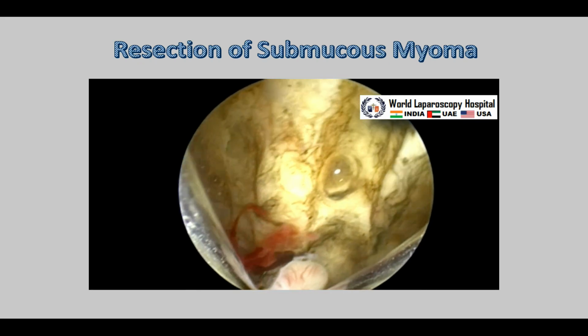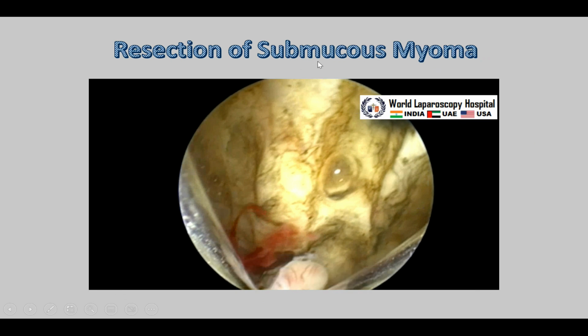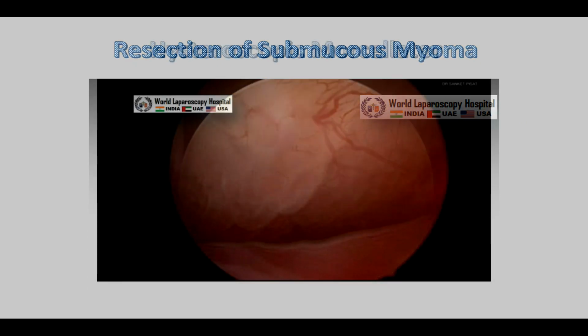If you see in the middle that you have a little more tissue, you can stop, remove the inner sheath, the outer sheath will never be touched, the inner sheath working element, put the Ehrlich evacuator, pump it and then again start.